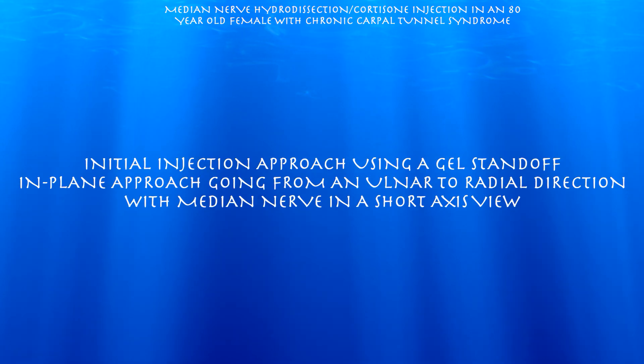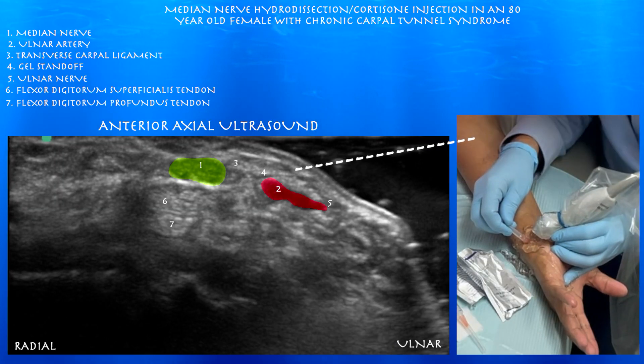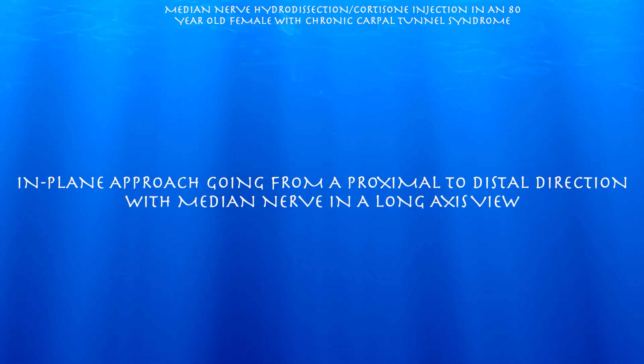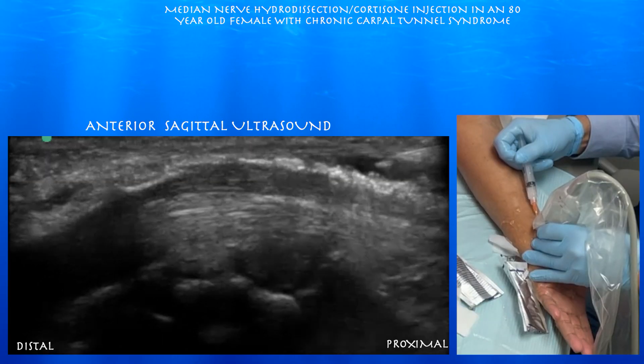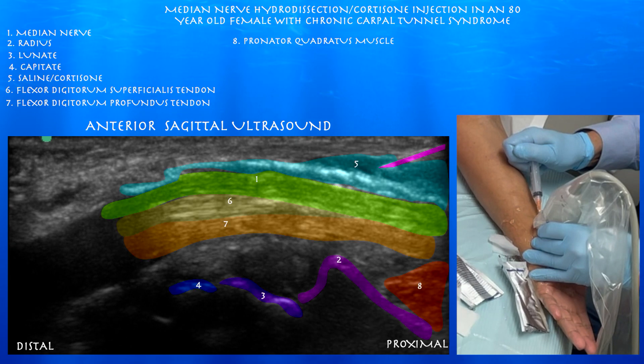This is our initial approach. We had a gel standoff, and we were essentially looking at the median nerve in a short axis view. Using that gel standoff, we were going to place the needle through that and try to get it between the median nerve and the ulnar artery, but it seemed just too much of a tight space, so I decided to go a different approach — essentially looking at the median nerve in a long axis view and just trying to get the tip of that needle above the median nerve.